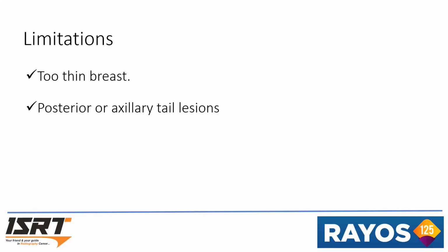There are a number of approaches to remedy the negative stroke margin. The planned approach can be changed and the breast positioned in the orthogonal position. The location of the lesion relative to the skin surface may change sufficiently to allow the safe insertion of the needle.